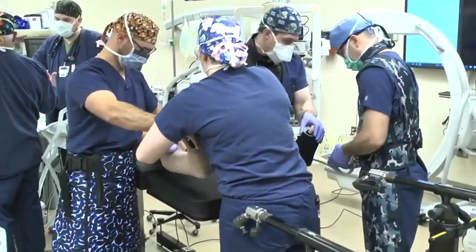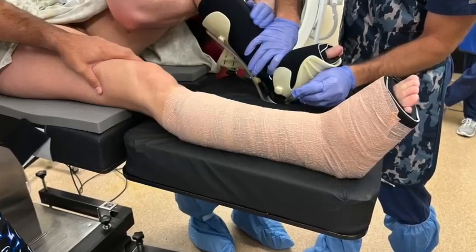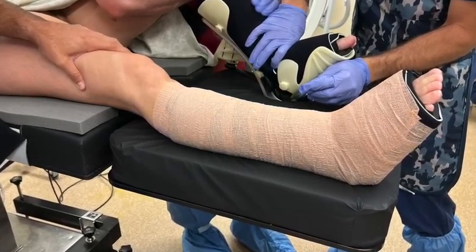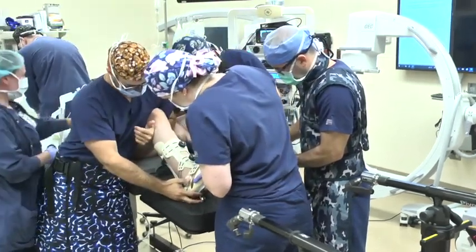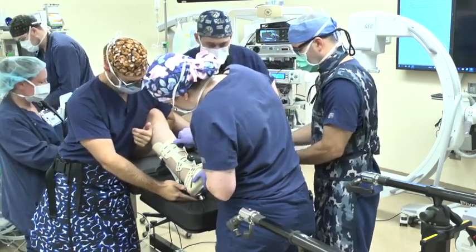Next, the heel and foot are placed in the plastic tensioning boot. The heel must be placed deep within the Velcro boot. The non-operative leg is placed into the padded boot and then directly into the traction boot, ensuring placement of the padded heel deep into the calcaneal recess of the traction boot.